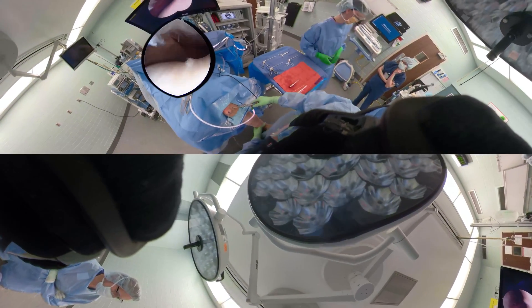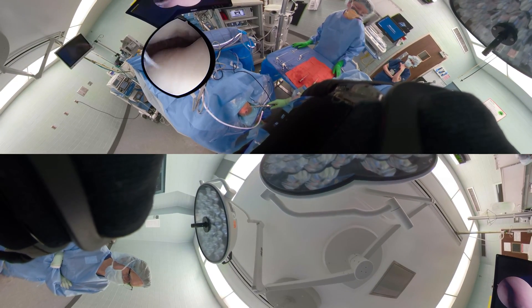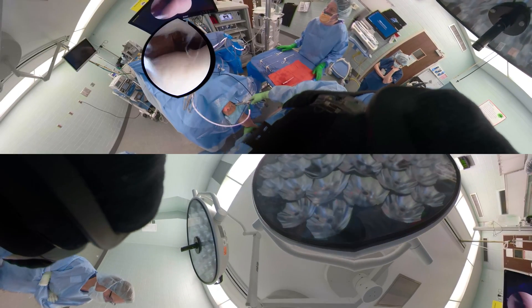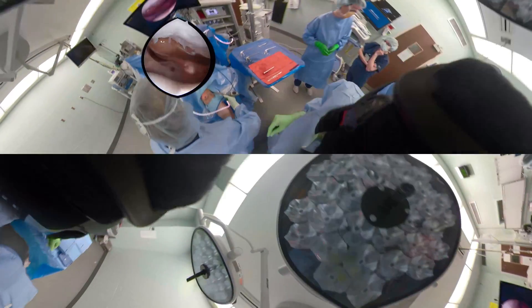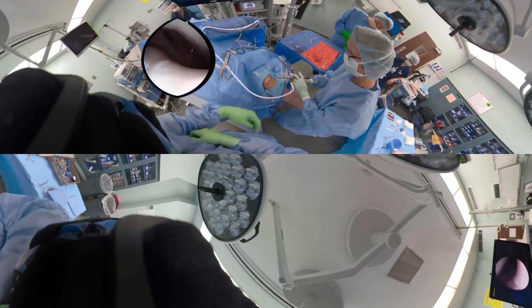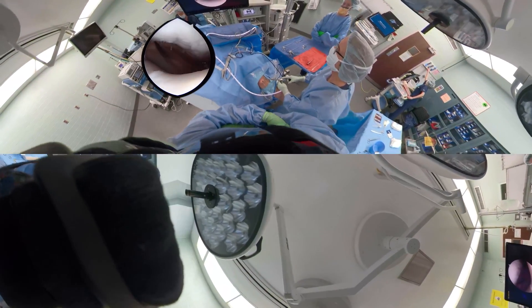Now we put the scope back in the lateral portal and watch how the patella tracks — moving the knee through flexion and extension to see the patellar tracking. She had one single dislocation. We're assessing whether she might be a candidate for patellofemoral realignment, but with a single dislocation and loose body removal, we don't need to do any major open realignment procedure.